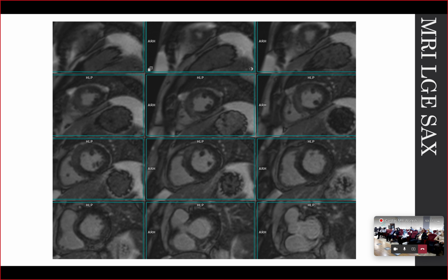And as we mentioned, this is a male. And I told you about the history that we received at MRI. And there is a piece of a clue that I didn't tell you about, because we didn't know it in the MRI until we went to the MDT. And they told us that one day before the presentation, this young male had a dog attack. Excuse me, had what attack? Dog attack. Oh, okay.